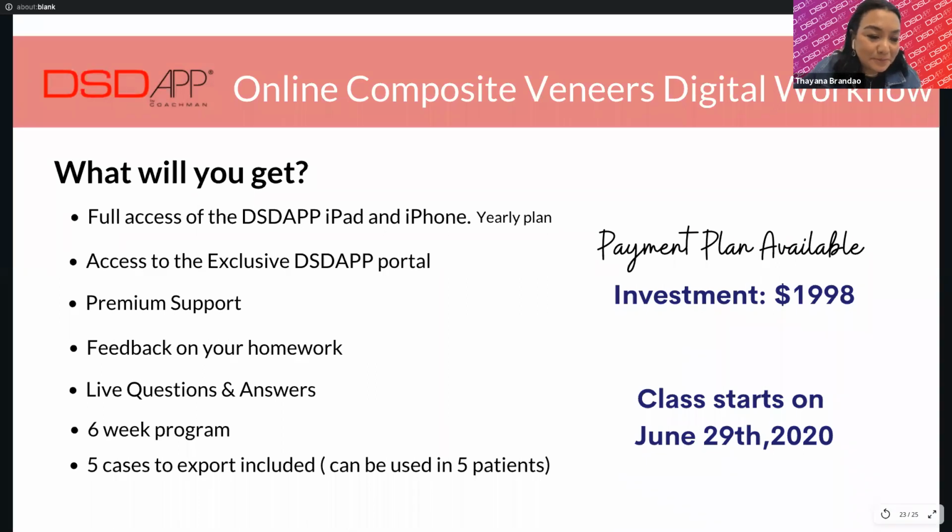Thank you, Diogo. Thank you, Dr. Tayana. Yes, just as Tayana was saying, it is priceless for you to become the owner of your own project. You'll be able to get your patient excited from day one. You will be able to make them understand the entire process, and you will be able to design that smile from start to finish. And this is a way for you to give harmonic smiles to all.